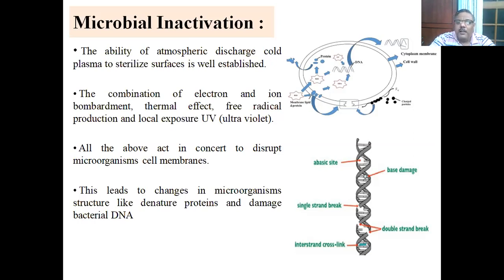Exposure to the gas plasma and the ultraviolet leads to changes in the microorganism structure and denatures the proteins.